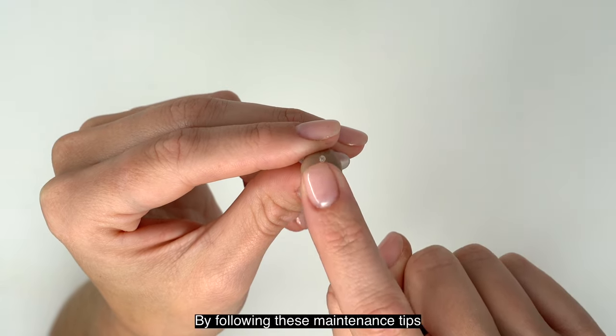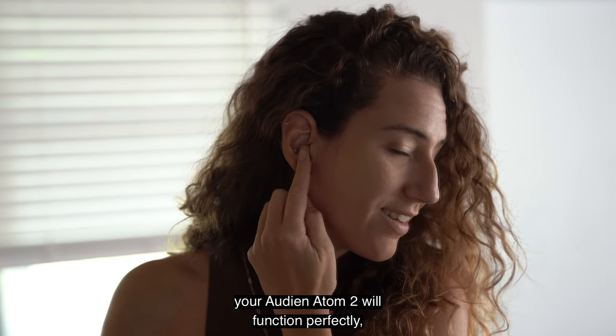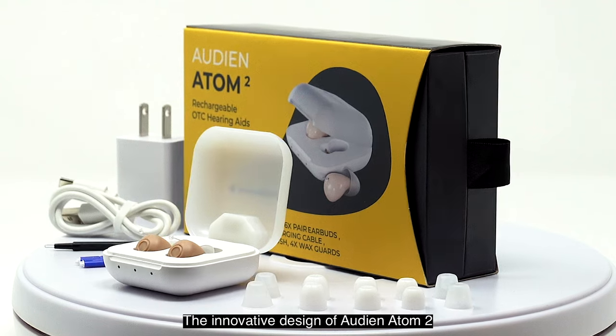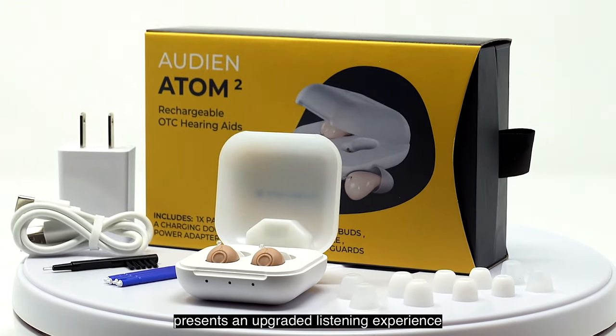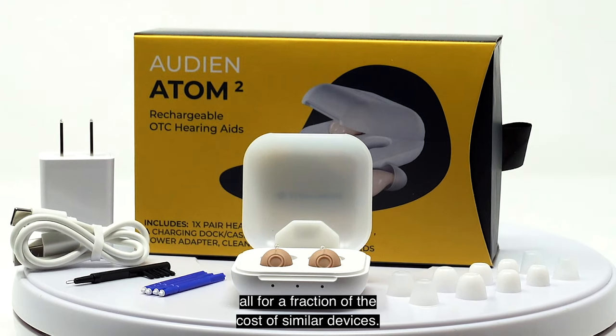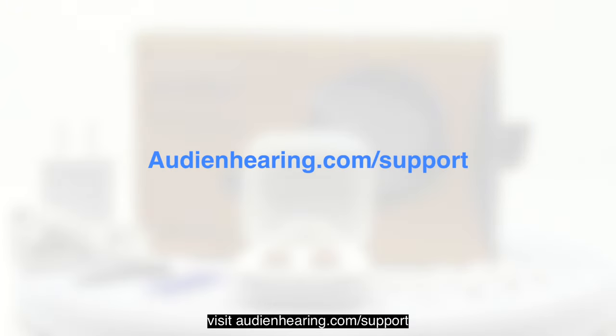By following these maintenance tips and troubleshooting guidelines, your Audien Atom 2 will function perfectly, offering you a superior hearing experience. The innovative design of the Audien Atom 2 presents an upgraded listening experience and a comfortable fit, all for a fraction of the cost of similar devices. To know more about your Audien Atom 2, visit audienhearing.com/support.